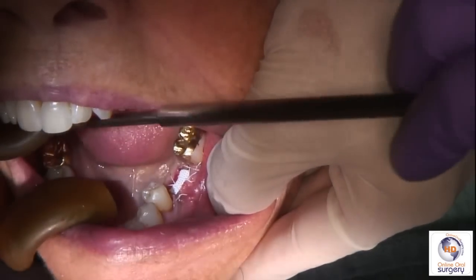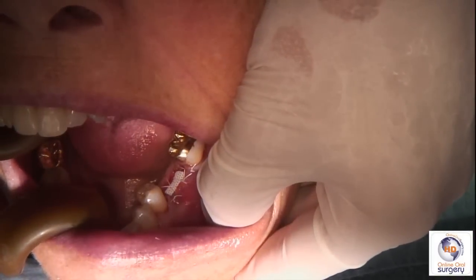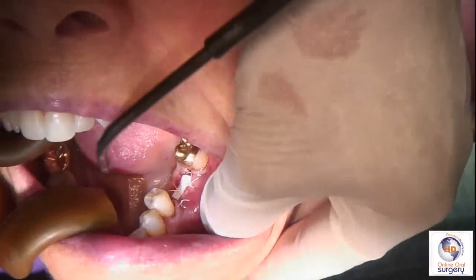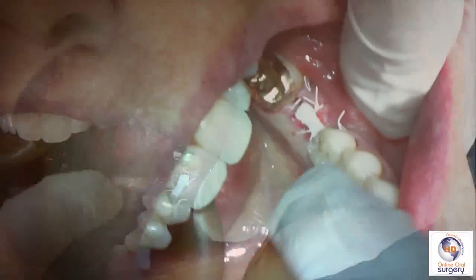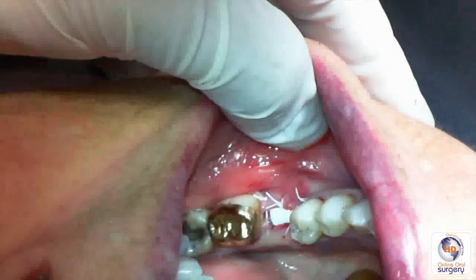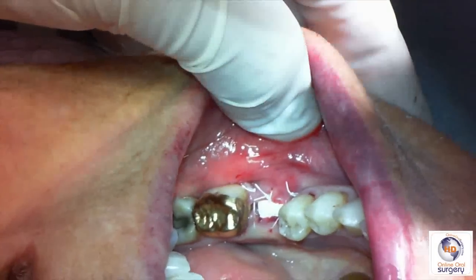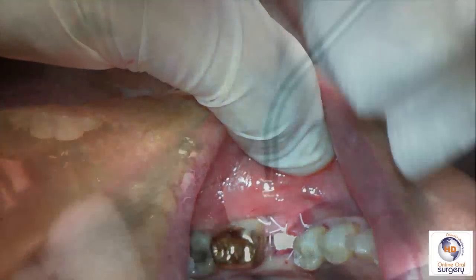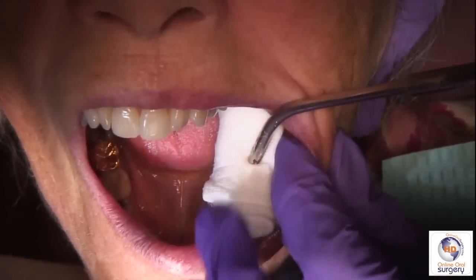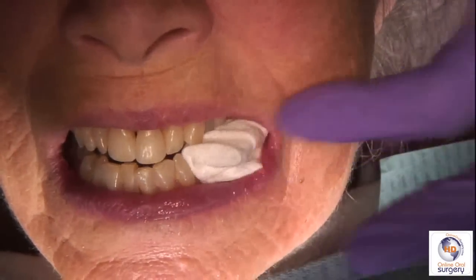We're going to go ahead and irrigate this off well. You can see that we've got the membrane nicely tucked underneath the flap of tissue on the buccal and on the lingual. The membrane is resting between the alveolar bone and the mucoperiosteal flap on both the buccal and lingual aspects. That's going to protect our graft while it's healing, and because of how it's tucked underneath the mucoperiosteal flap, the membrane itself will not displace until we're ready to take it out. If you don't undermine the buccal and lingual flaps enough, it's possible for the membrane to come loose during the healing period. Having the patient bite down on some gauze wraps up our extraction of tooth number 19 with ridge preservation grafting.